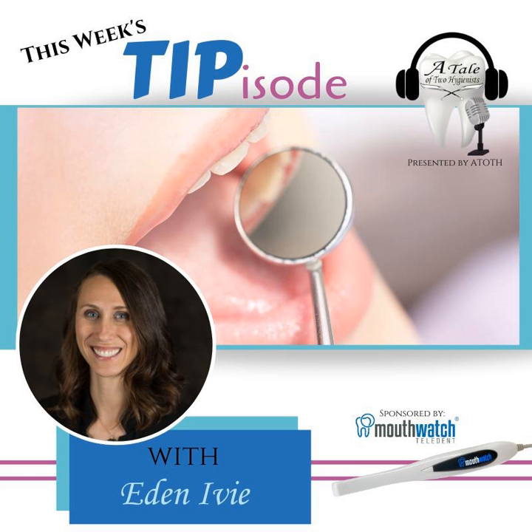But if you can snap an intraoral picture, which takes 0.2 seconds, you're going to have a very clear documentation of what that tissue or tooth looked like on that day, and it's very easy to compare when it comes back and know without a doubt if anything has changed.